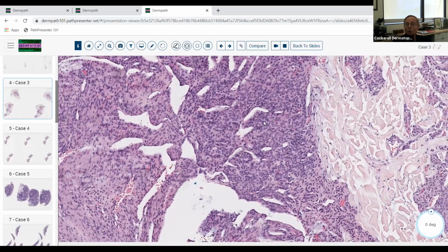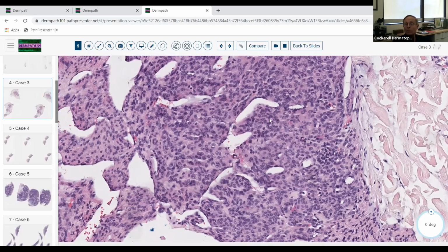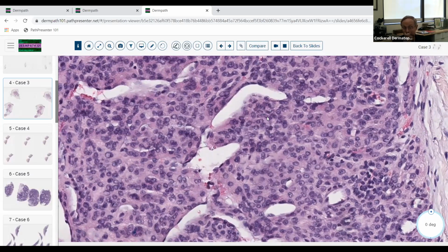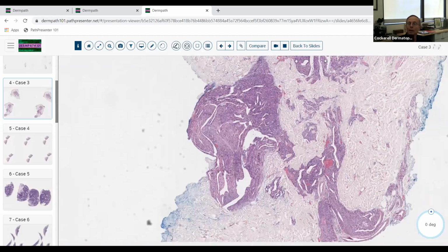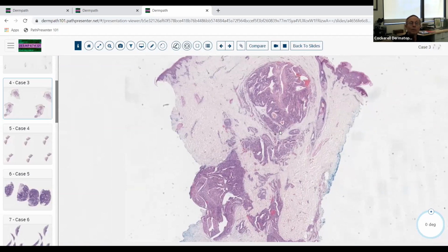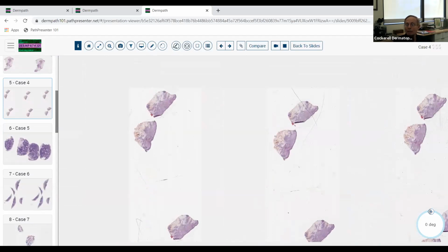The way those glomus bodies work is that these are myoepithelial cells. They would stain positive for smooth muscle actin. These cells have actin filaments. They constrict. They cause the blood vessels to constrict, and then basically your blood gets shunted into the internal part of your body from the external part. So that is a glomangioma. Hopefully everybody got that right, because that's typical good potential board fodder. That's something you could be asked about on the examination.